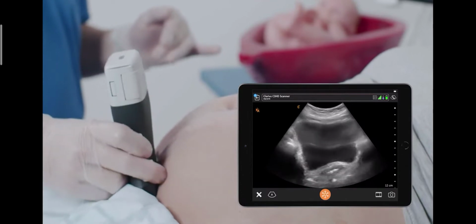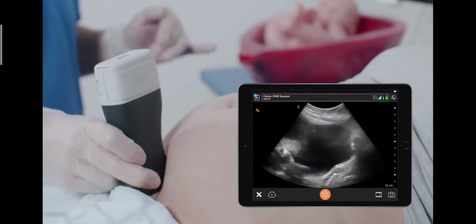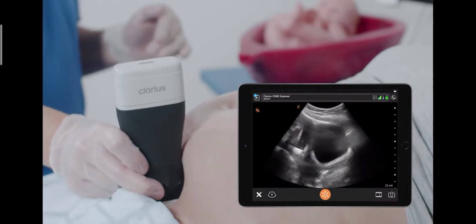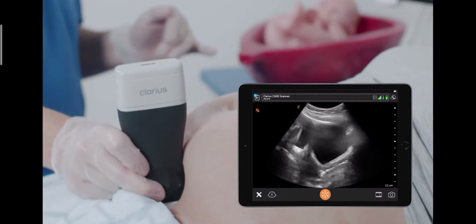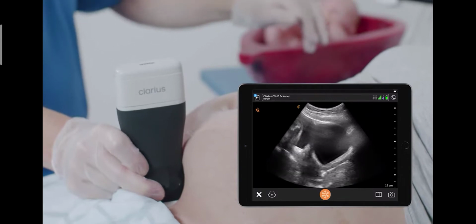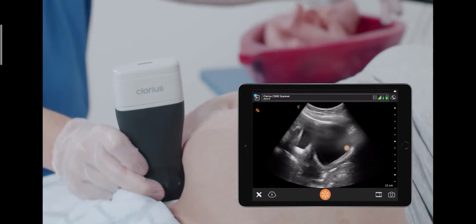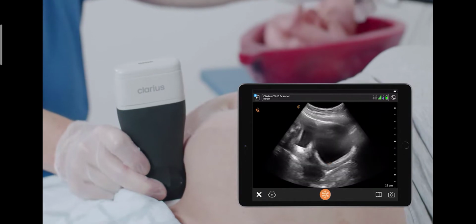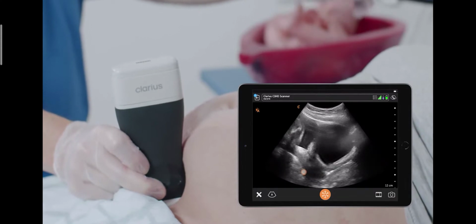This is the echogenic vagina, and I can see the cervix of the uterus. It is usually measured by doing a transvaginal scan, but here I can still see it is long and closed.